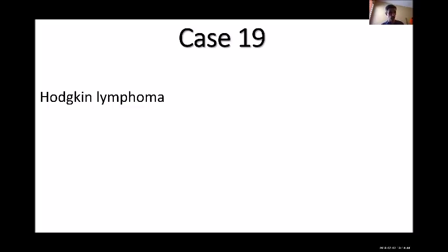So what I said, it looks like a chronic infection. Okay, it looks like a chronic infection, but mostly maybe tuberculosis, but I might be wrong. So I did have a way to go back. Okay, so it wasn't tuberculosis, it was lymphoma.